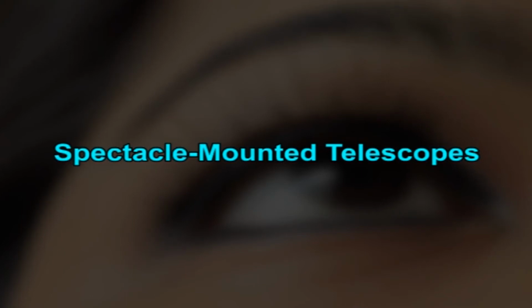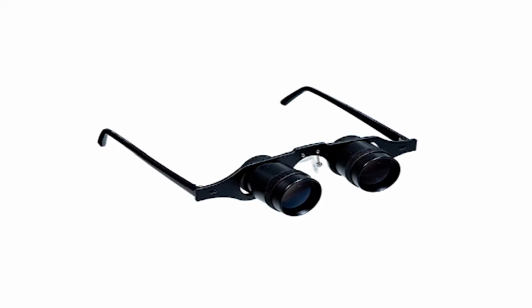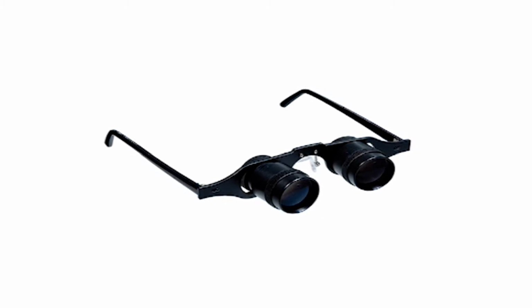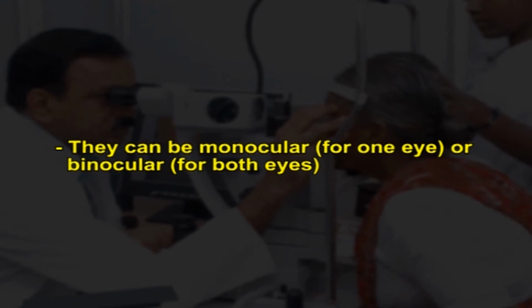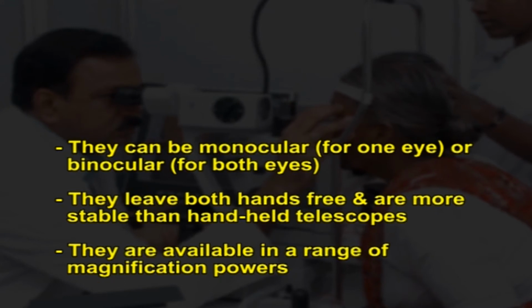Spectacle mounted telescopes. Spectacle mounted telescopes are permanently attached to the lens of the eyeglasses. The advantages of spectacle mounted telescopes are they can be monocular, that is for one eye, or binocular for both eyes. They leave both hands free and are more stable than handheld telescopes. They are available in a range of magnification powers.